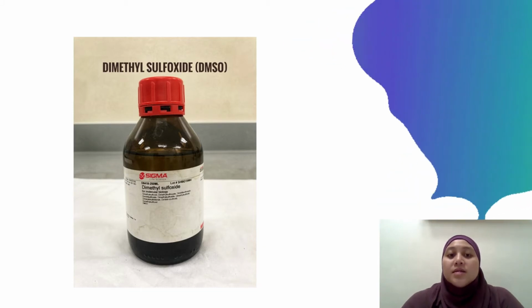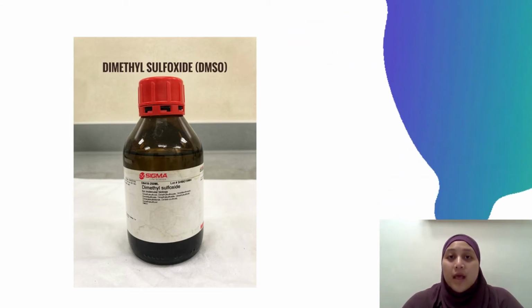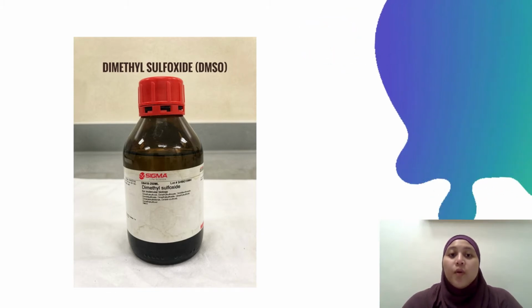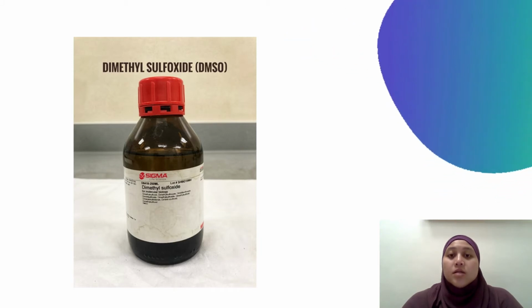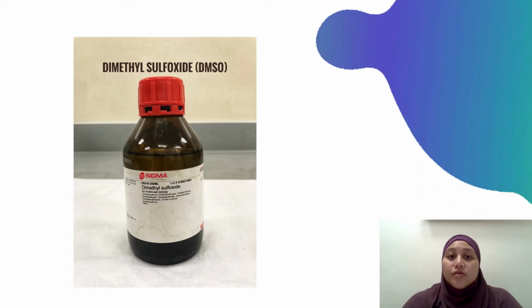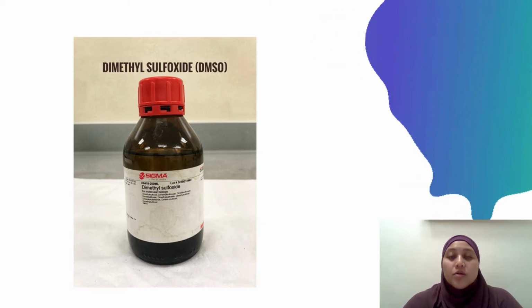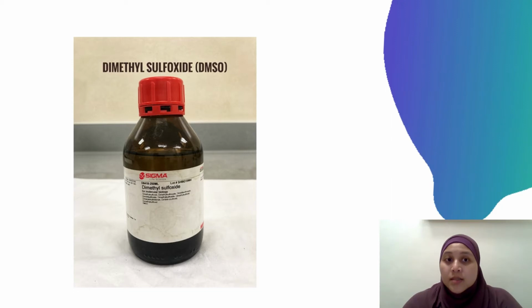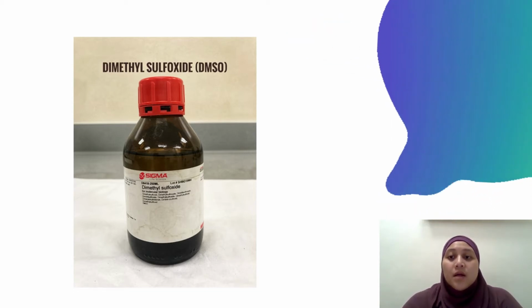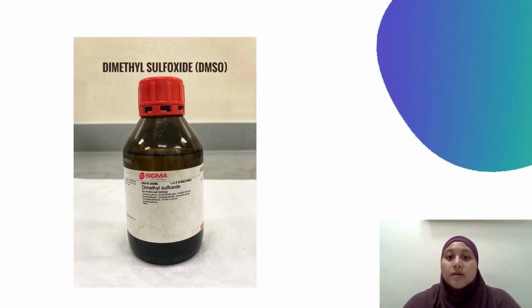This is a chemical known as dimethyl sulfoxide, or DMSO as an abbreviation. DMSO is a colorless solvent and is used to dissolve both polar and non-polar compounds. In medicine, it is used as a treatment of interstitial cystitis, and leakage of intravenous drugs from vein into surrounding tissue, or known as extravasation. It is easily absorbed by the skin and used in conditions such as scleroderma and scars.